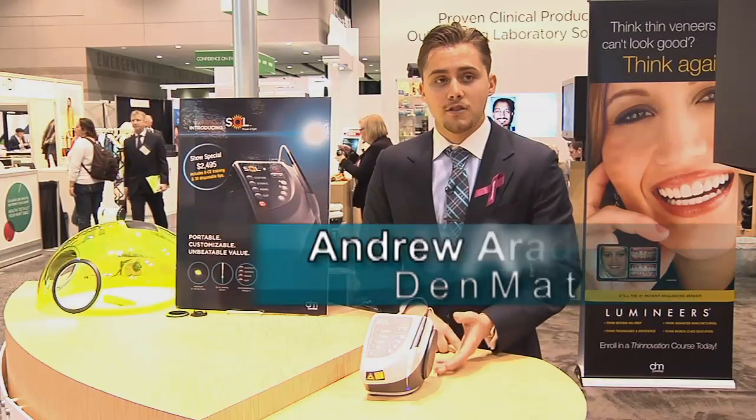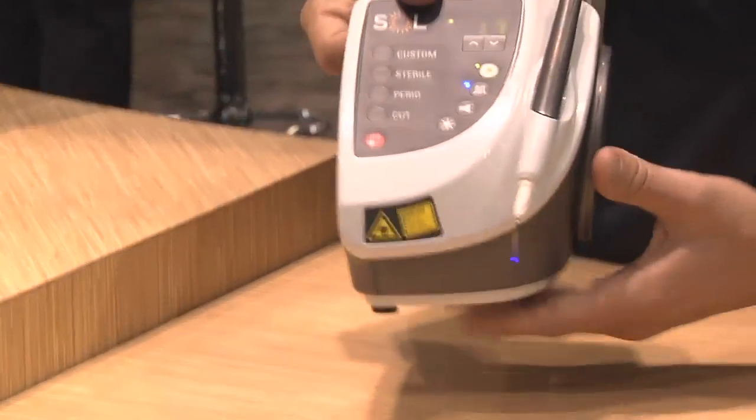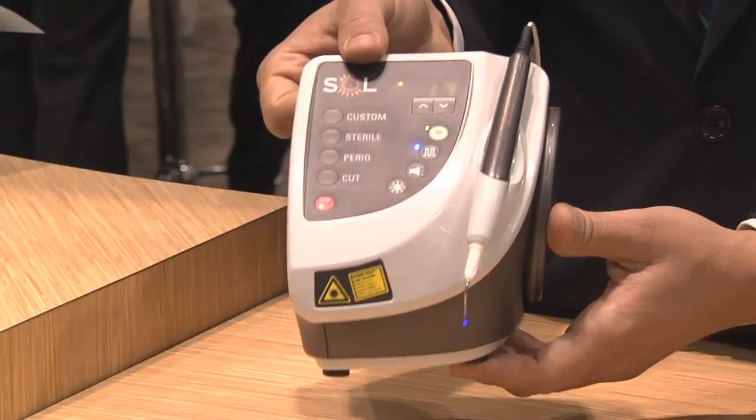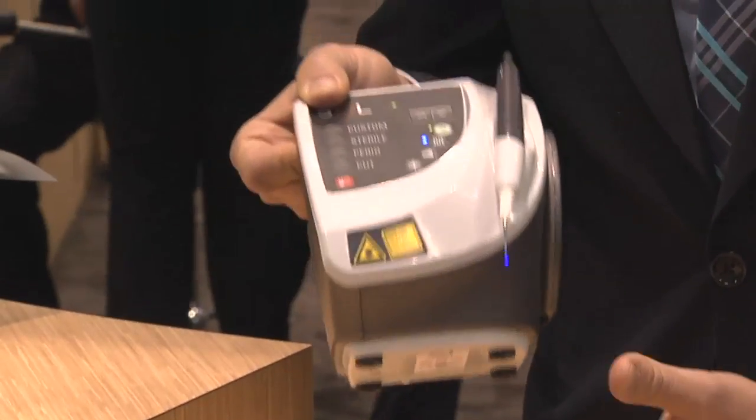Today I'm going to talk to you about our newest laser, the Sol portable diode laser. What's great about the Sol laser is the portability of it. It has a premium internal battery that allows over three hours of use at continuous wattage, and a convenient carrying handle to allow access to multiple operatories.